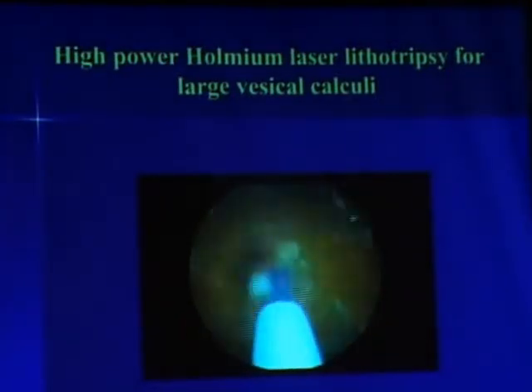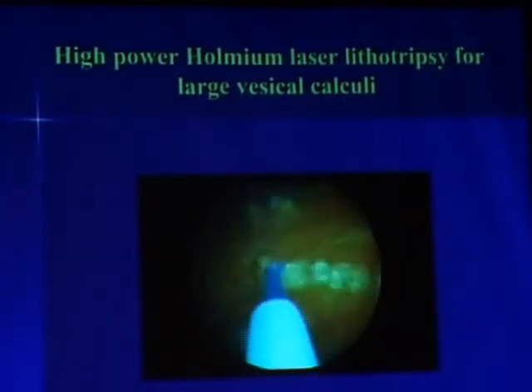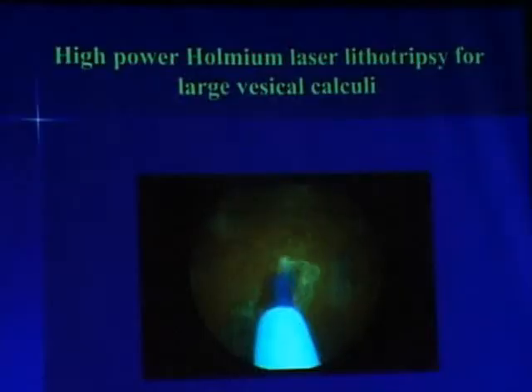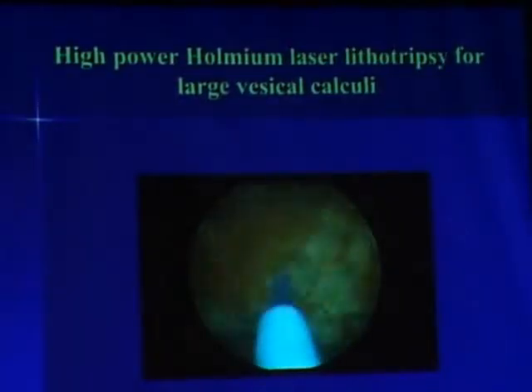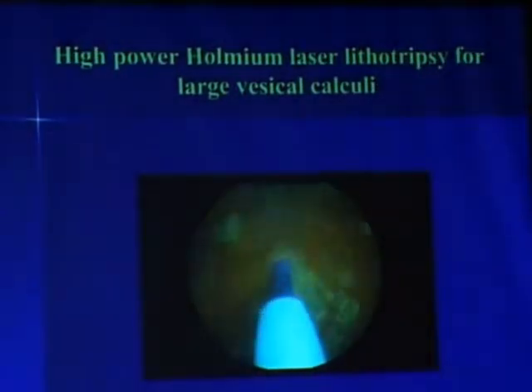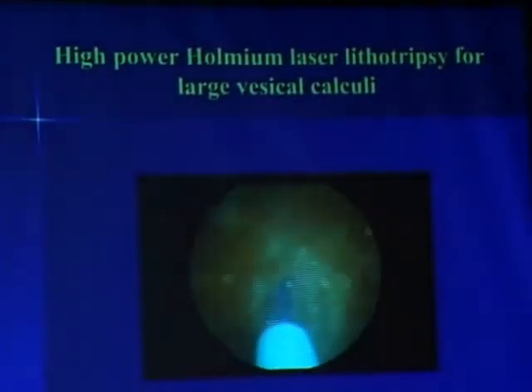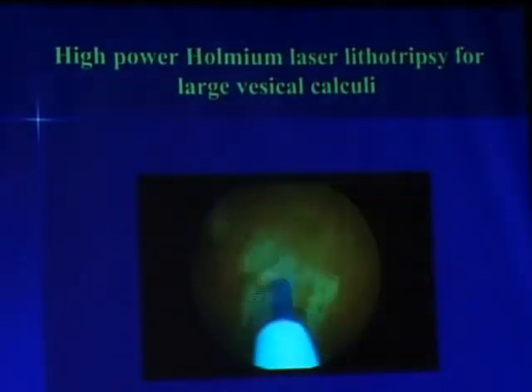This is how the slow energy of 10 watt will do on the bladder. It's just doing a small job, and it's very time consuming to continue with this low energy. But the moment we increase the energy, we can see the difference. It really makes deeper holes, and the stone gets fragmented completely.